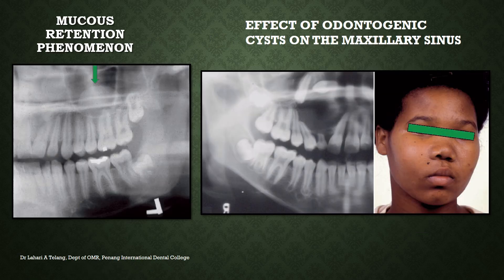This is another example using a panoramic image to observe a mucus retention phenomenon, seen as a radio-opaque soft tissue mass within the floor of the sinus. The image on the right shows the effect of an odontogenic cyst on the maxillary sinus — the floor is pushed up and the entire cyst occupies the maxillary sinus with displacement of impacted teeth. The patient has a large swelling over the cheekbone area with even involvement of the nose.